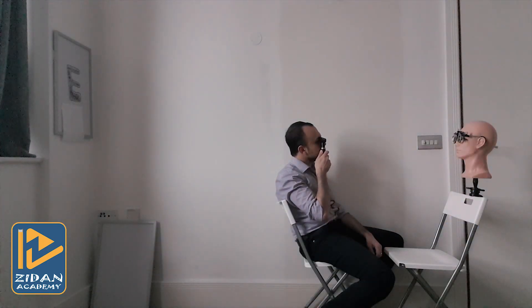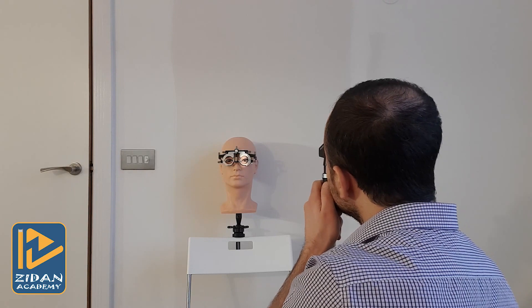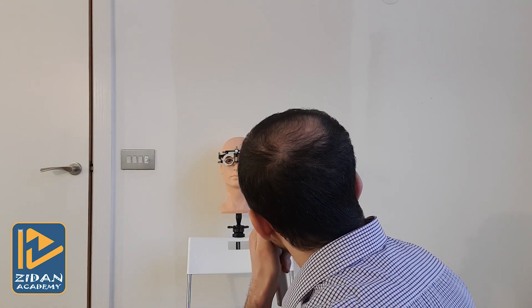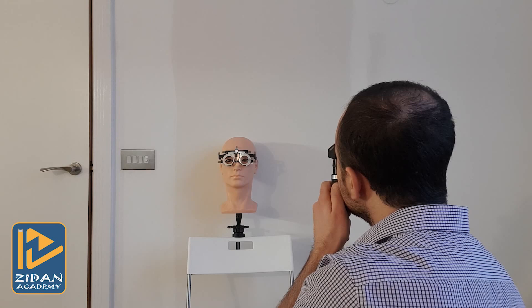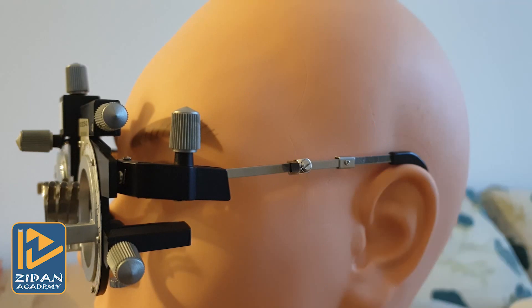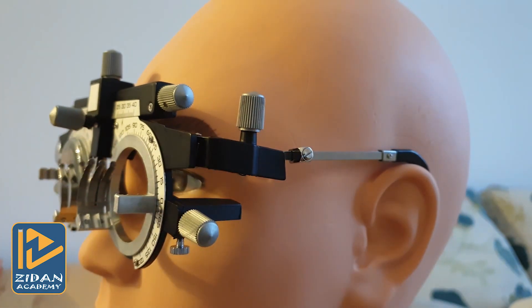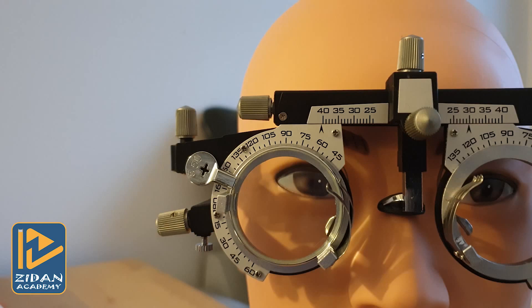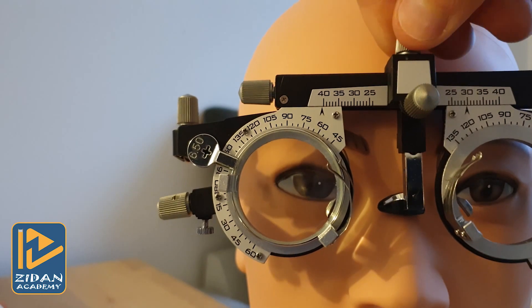While doing retinoscopy, you should adjust your position to be as close as possible to the patient's visual axis, either vertically or horizontally. Performing retinoscopy off-axis by more than 15 degrees may affect your final results. While using a trial frame, try to make sure it is well adjusted to avoid errors from large back vertex distance or errors related to decentered lenses such as prismatic effect. Always make sure the patient is looking through the center of the lens.